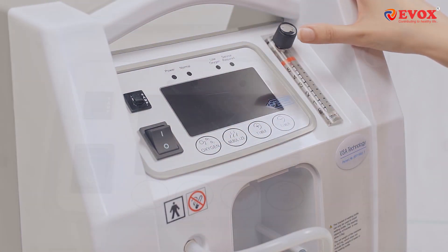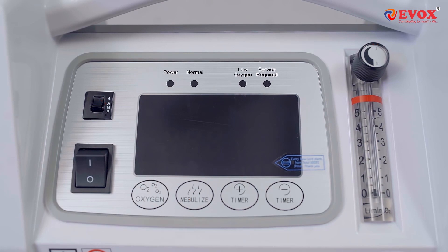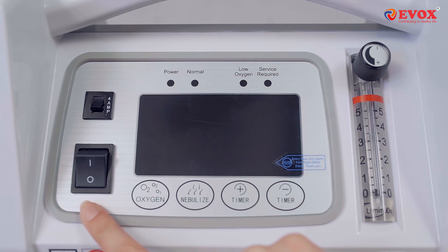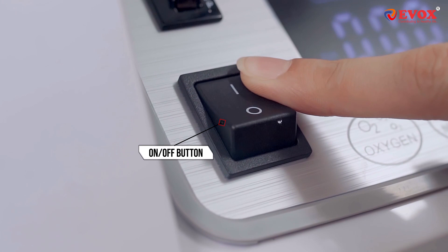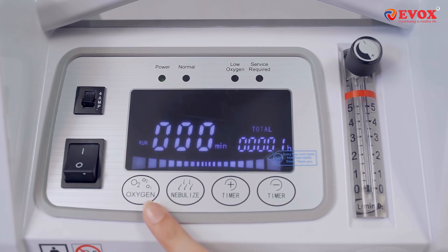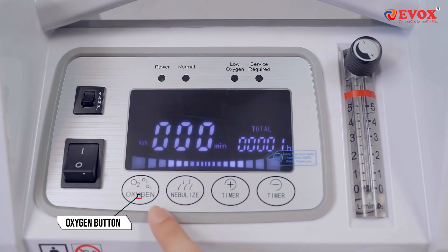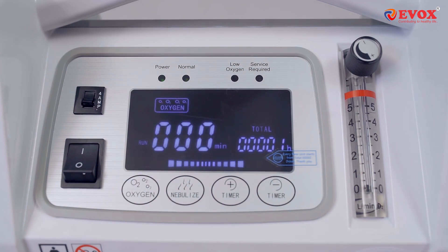This is the main panel. Switch on the machine using the on/off button. Once the concentrator starts working, wait for 2 minutes, then press the Oxygen button so the concentrator reaches the optimum purity level.